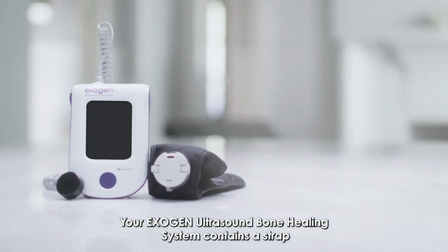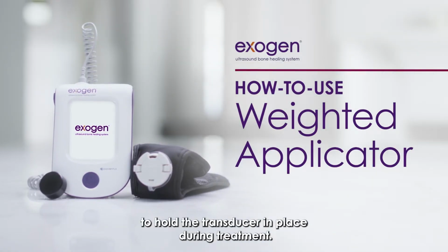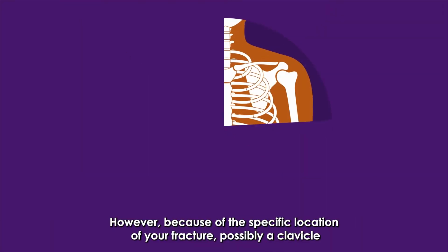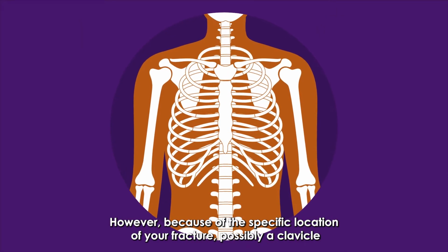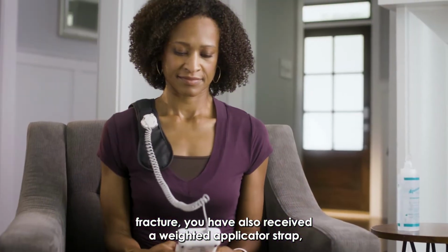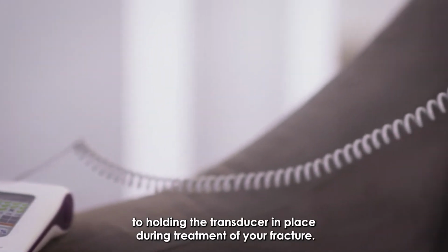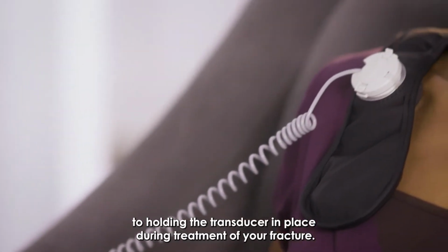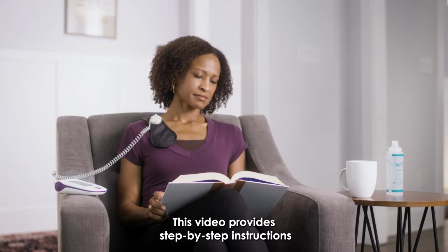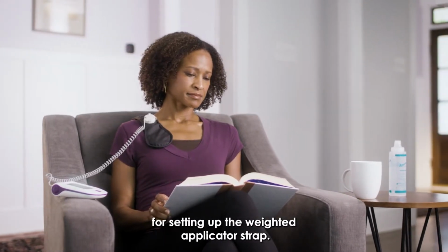Your EXOGEN ultrasound bone healing system contains a strap to hold the transducer in place during treatment. However, because of the specific location of your fracture, possibly a clavicle fracture, you have also received a weighted applicator strap, which is better suited to holding the transducer in place during treatment of your fracture. This video provides step-by-step instructions for setting up the weighted applicator strap.